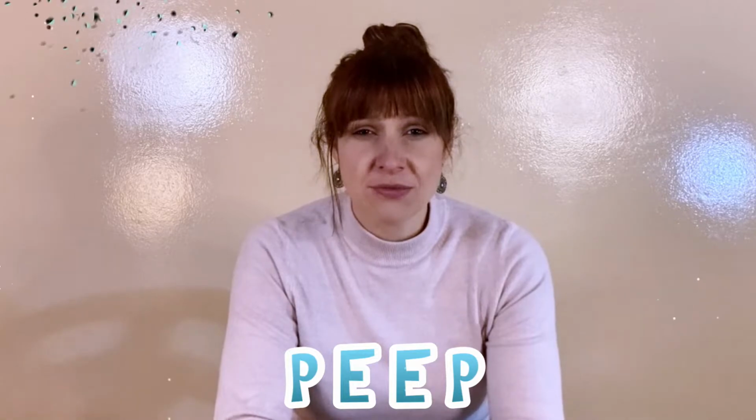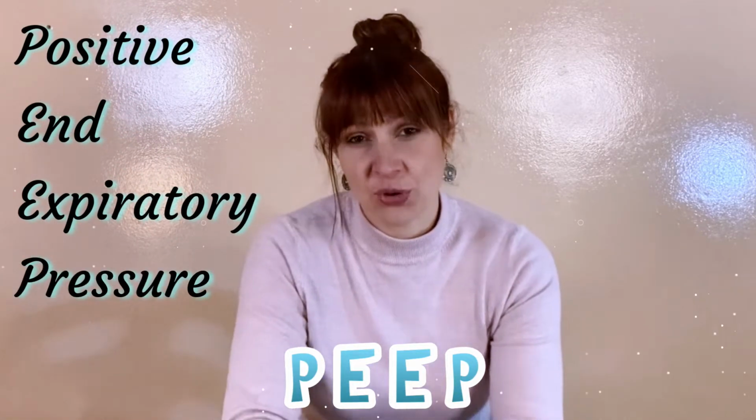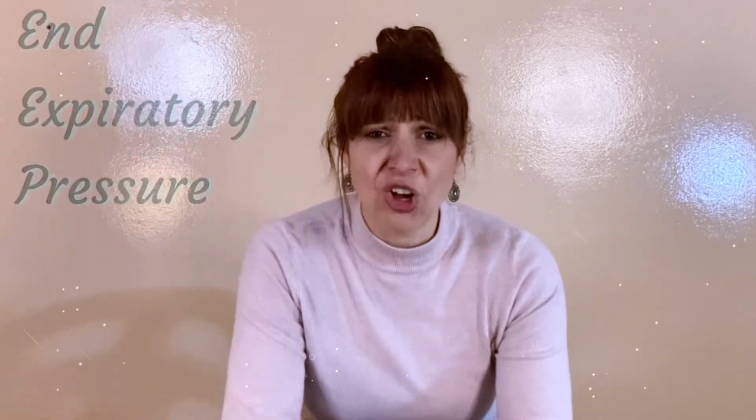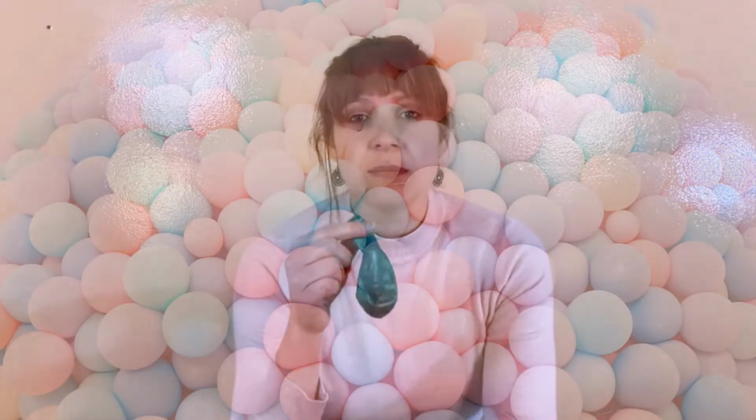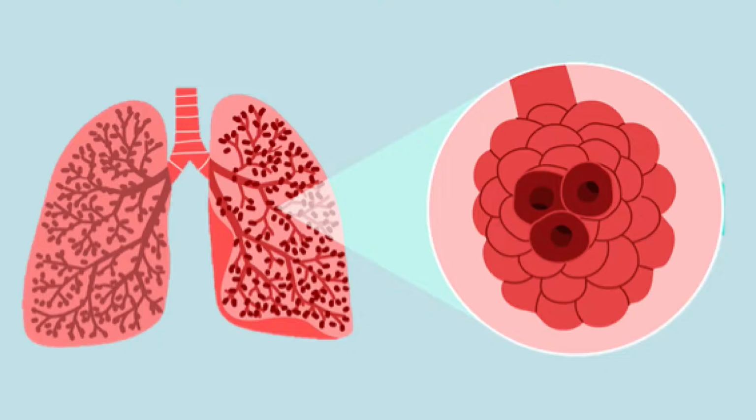The second key concept of ventilation is PEEP, positive end expiratory pressure. Now, if that sounds like a long and intimidating name to you, don't be surprised, most people find it a little bit confusing, but by the end of this video, you are going to nail PEEP. Now, the lung is basically a balloon, or to be more accurate, it actually consists of millions and millions of tiny little microscopic balloons. We call them alveoli.